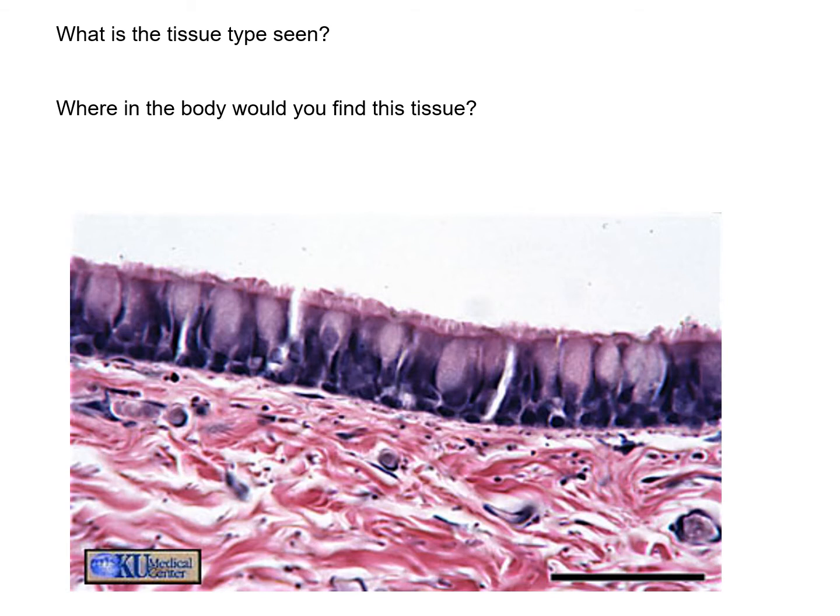Simple columnar? It is not simple columnar. This is the ciliated trachea. Stratified columnar? It's pseudostratified ciliated columnar. You can see the cilia up at the top of the cells, and in between them you have goblet cells. So yes, you could see this in the trachea. You could also see it below the vocal cords of the larynx.